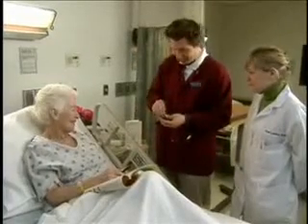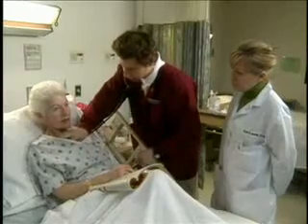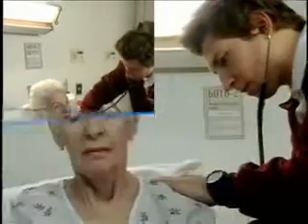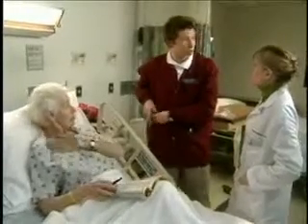Okay. You mind if I just take a listen to your chest? Okay. Thank you. Okay, you can sit back down now. Now I'm just going to hook up the humidifier and connect the nasal cannula to the oxygen source and flow meter. Great.